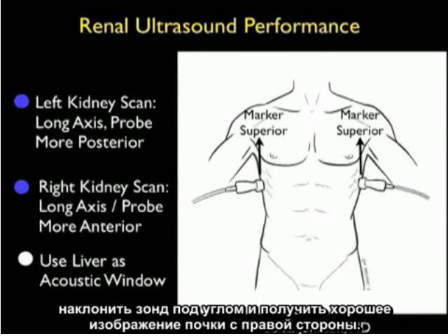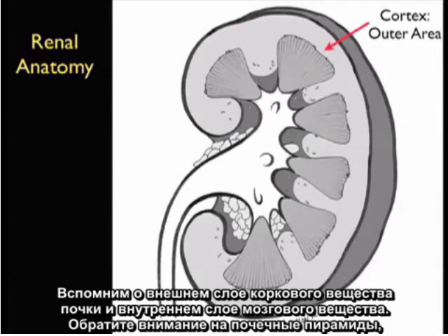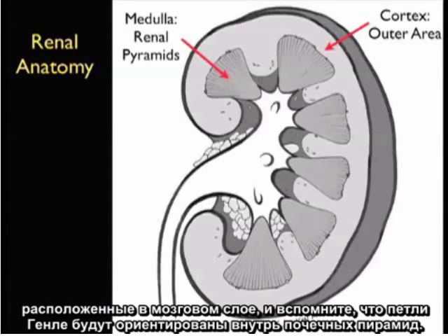Here's an illustration of the kidney that's important for bedside ultrasound of this structure. Recall the outer area of the kidney, the cortex, and interior to the outer cortex, we see the medulla. Notice several renal pyramids located within the medullary area, and recall that the loops of Henle are going to be oriented inside the renal pyramids.